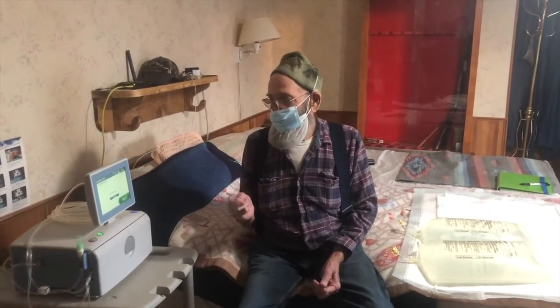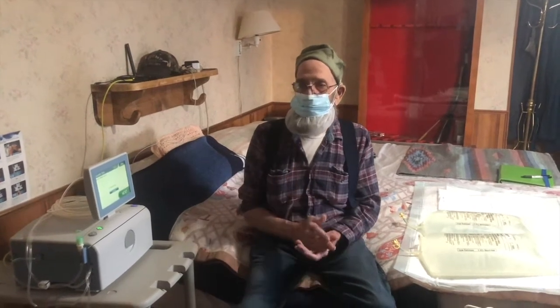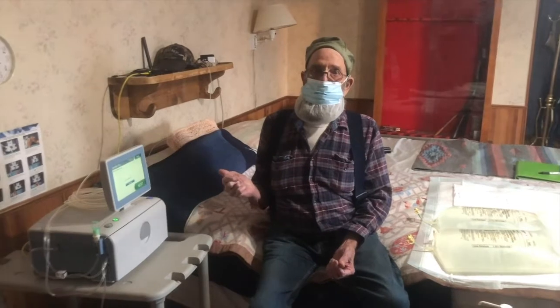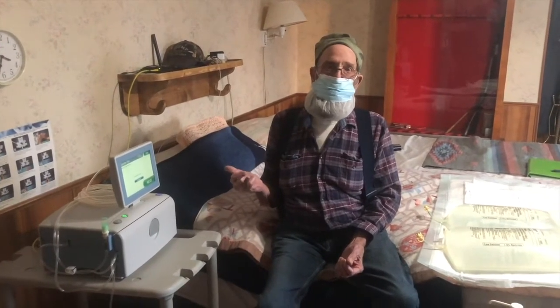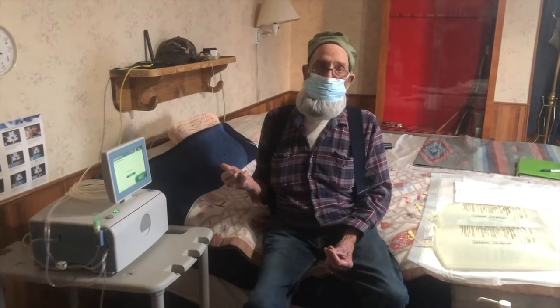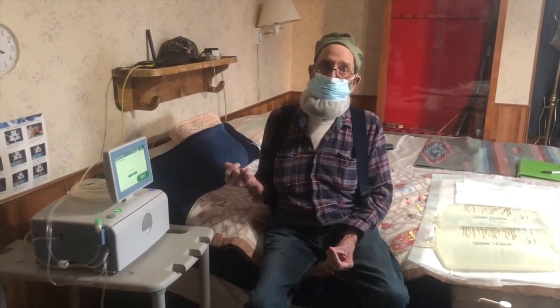As soon as that's done, we hit the pause button, and this machine will hold your stuff for you for 5 hours. So you can do this 5 hours ahead of time, which is really nice because that gives the machine time to heat all your fluid up and stuff.